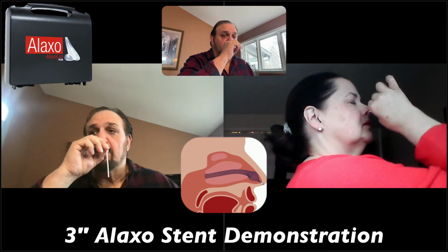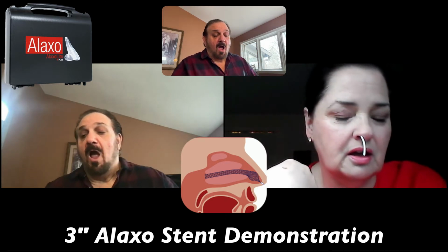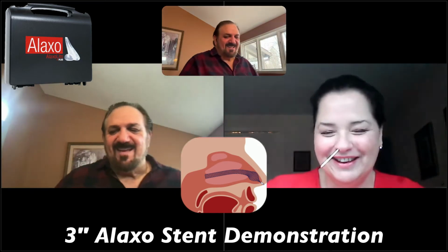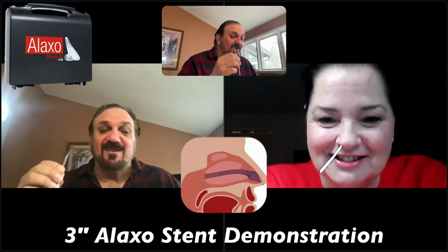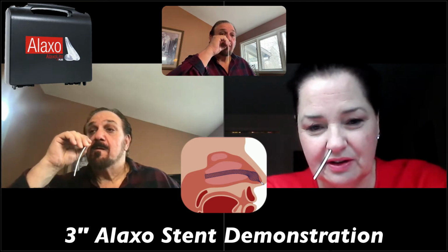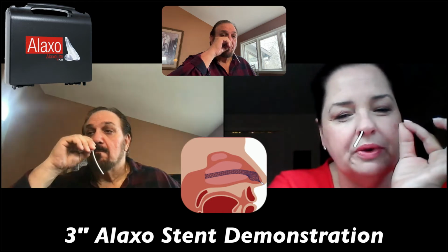Okay, it does seem to go further when I do that, but all of that is still... Because I think you were getting into the middle meatus instead of the... Oh, you tried it. Yeah, sneeze. That's all normal. Okay. I don't usually sit on camera with a thing stuck in my nose, but here I am. This is why I wanted to try the short one before the long one. Okay, there you go, yeah. And you'll find it hits a hard spot, but then if you go laterally to the left or the right, you'll find a little opening.